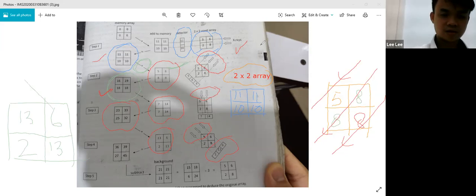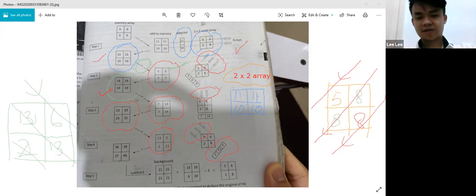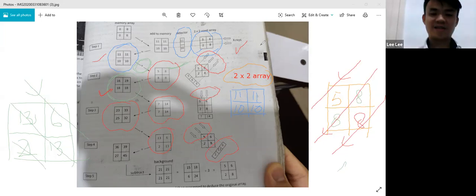So the working is, this is one slice here. This is the second slice. The 13 is the second slice. Then the 2 is the third slice. So that 3 here, like this, right? You place it in this way. Move like this. Any question? The number 5628. Yeah, that's just an example.